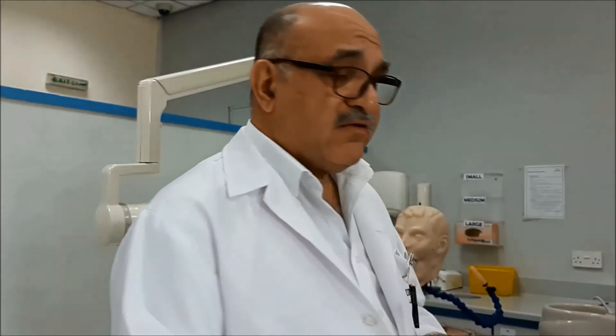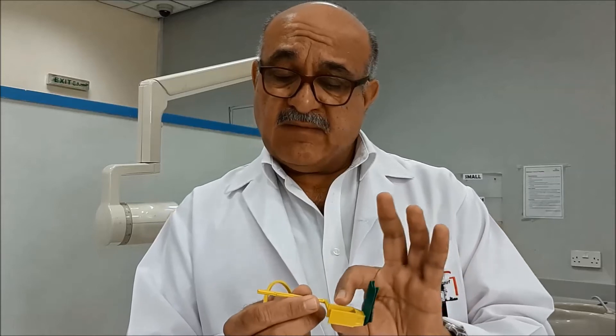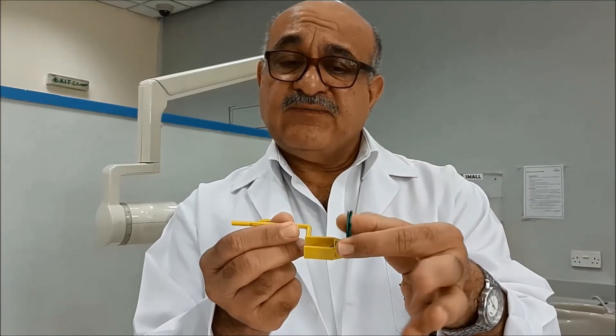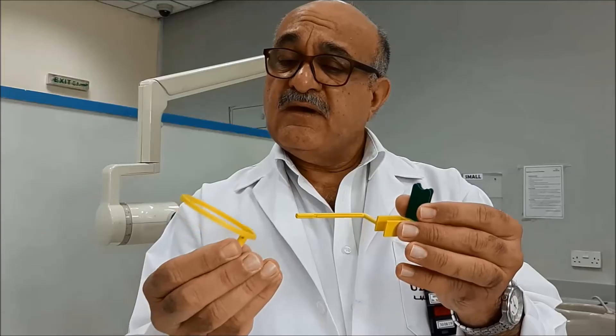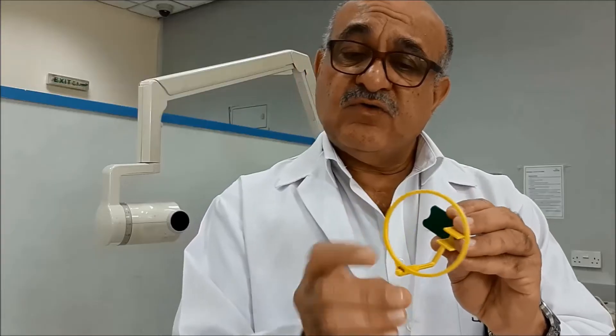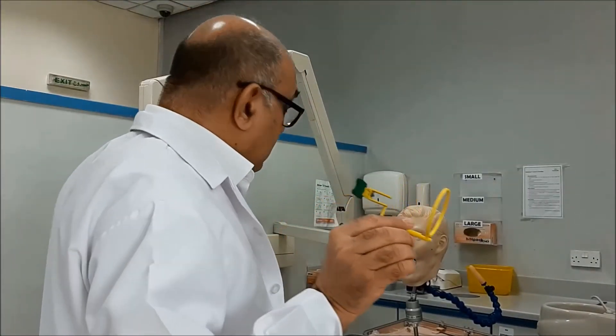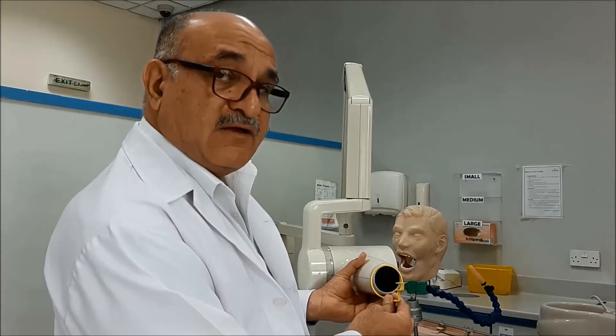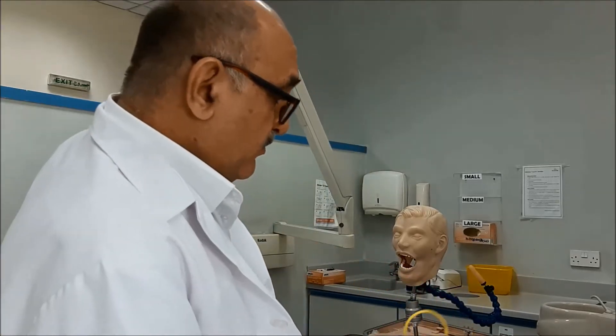The KERR film holders, or sensor holders, come in three types. Their basic components are the same: they are all composed of a connecting rod, a bite block on which the patient bites using their teeth, and the sensor holder. They also come with a ring aligner, which is used to guide and direct the beam so it will be aligned with the PID or the cone of the x-ray.